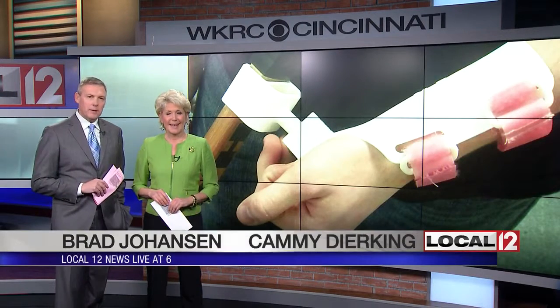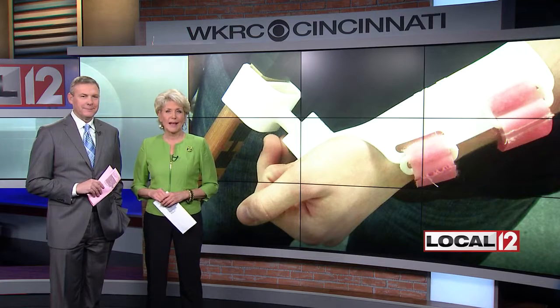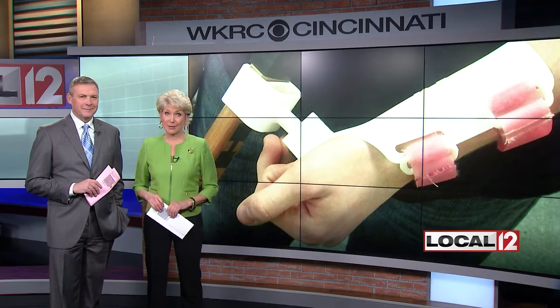A hockey player has a new piece of equipment — a prosthetic brace created by Milford High School students. Local 12's Megan Mangiello shows us how this is a game changer.